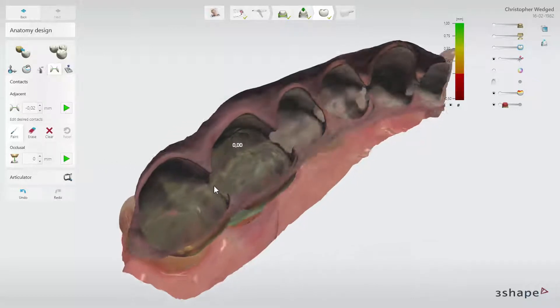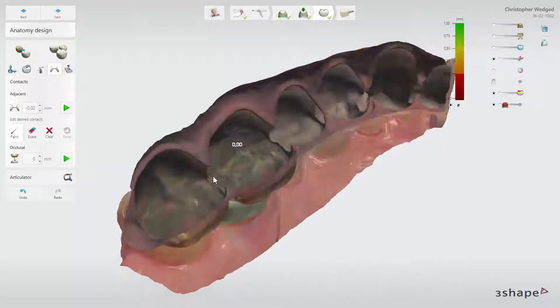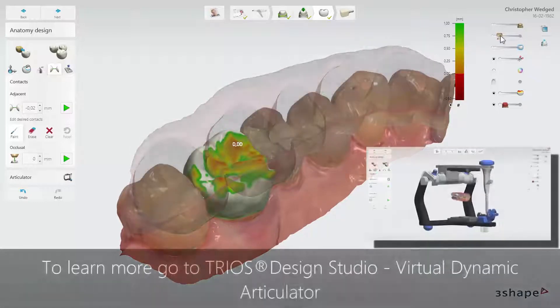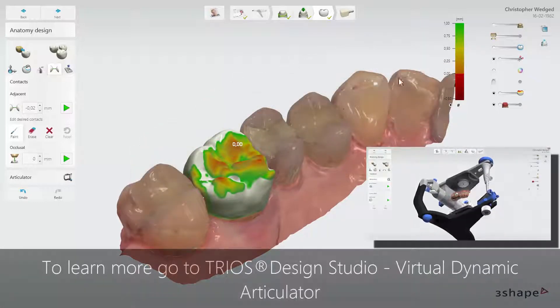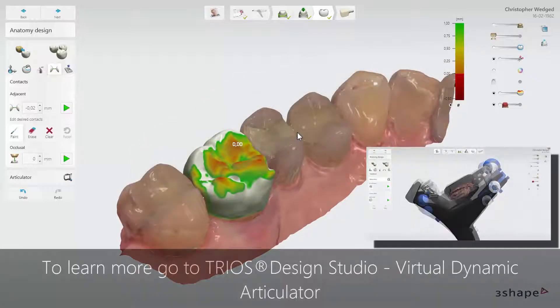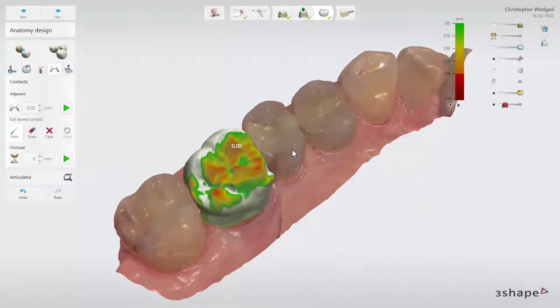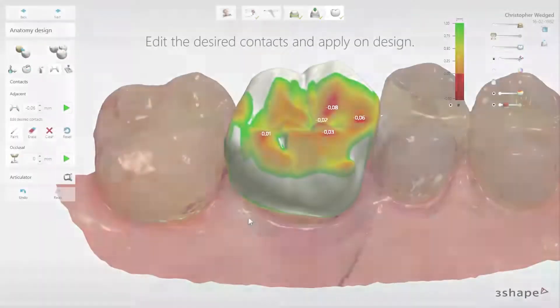The changes will be applied in the given static occlusion. To learn how to adjust occlusal contact points in dynamic articulation, watch the Trios Design Studio Virtual Dynamic Articulator video.